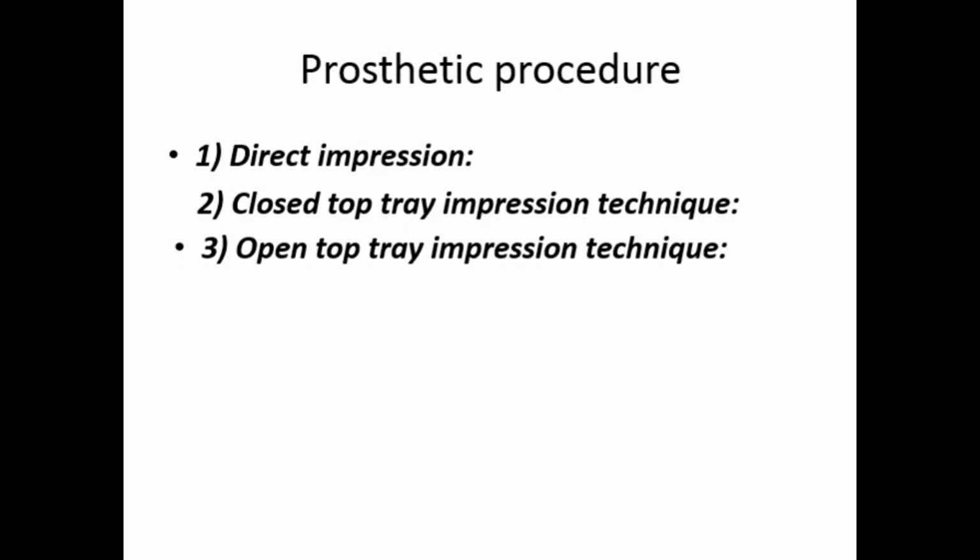The impression is sent to the lab where the abutments are reduced and path of insertion is adjusted. The open top tray impression technique is the same, but the tray is open to avoid misplacement of the transfer copings in the impression.